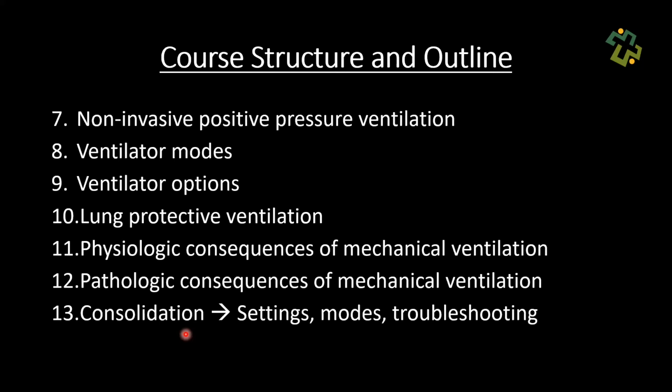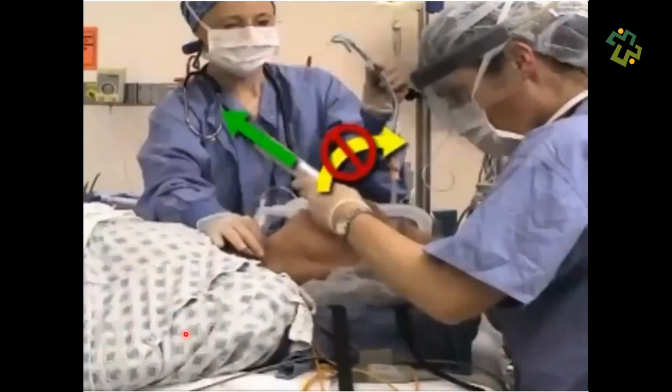And then I also have access to an online ventilator simulator. So that will be the last session where we go on this online vent simulator and I introduce you to a variety of different vents and how to actually go about setting up the vent, albeit not physically, but on online simulation, okay?